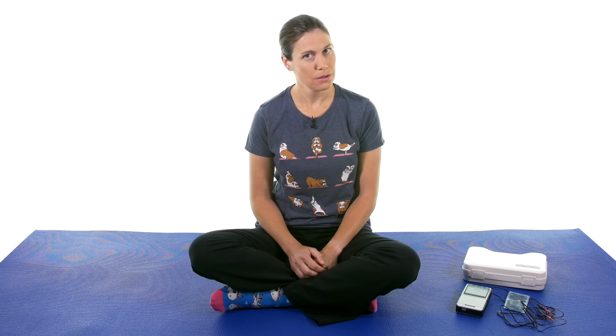So first off, what is TENS and EMS? TENS is transcutaneous electrical nerve stimulation — that's why usually people just call it TENS. EMS is a general term for electrical muscle stimulation. In some places you might see different letters like neuromuscular electrical stimulation, but usually EMS is just the general term.